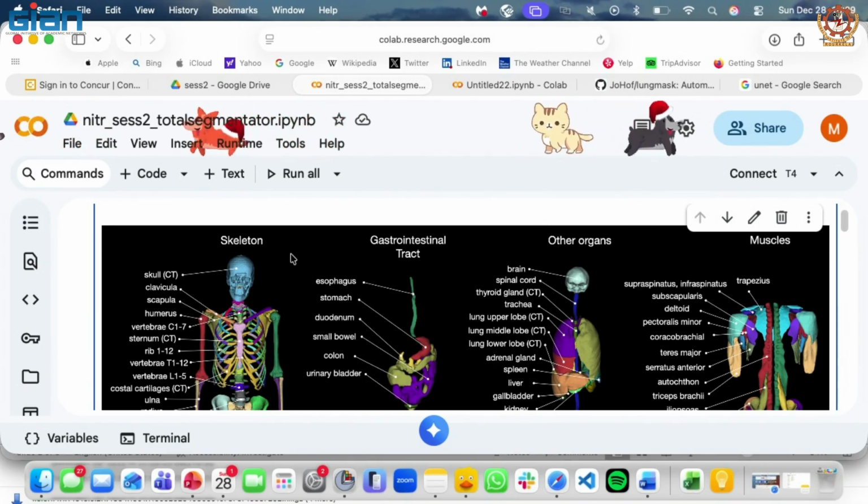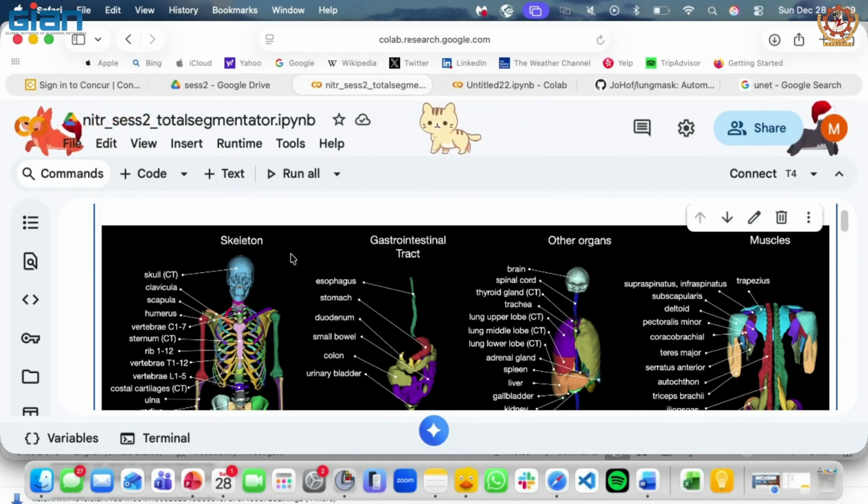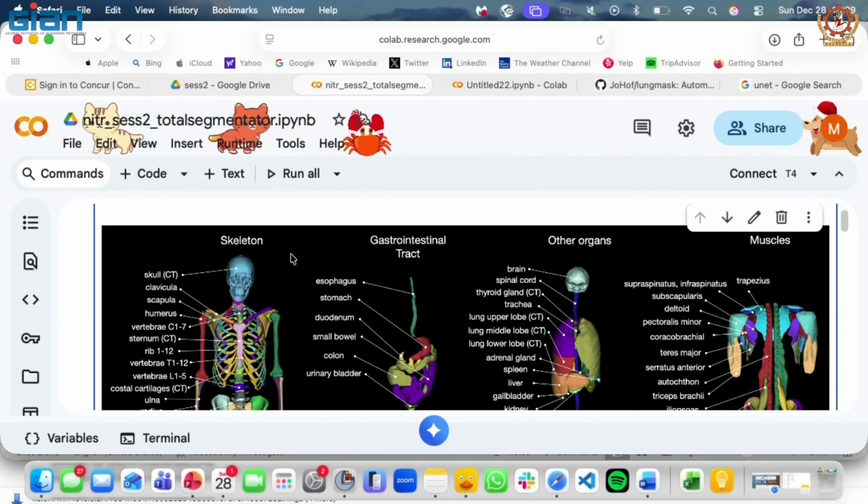I told Pratik, see, we were talking about this, and now it's out in public, and he was like, no, that's not true. Then I had to show him a demo that, yes, see, this works, and they have a visualization, a platform where you upload the CT image and it will give you a segmentation.